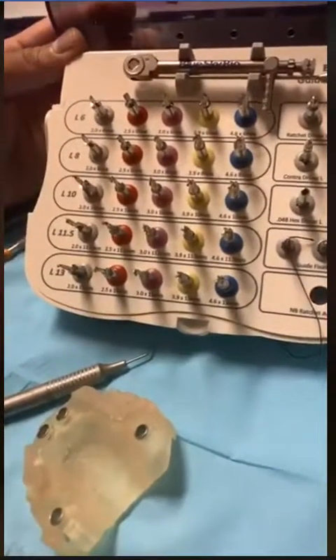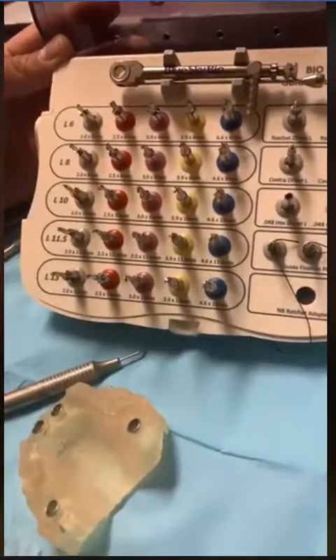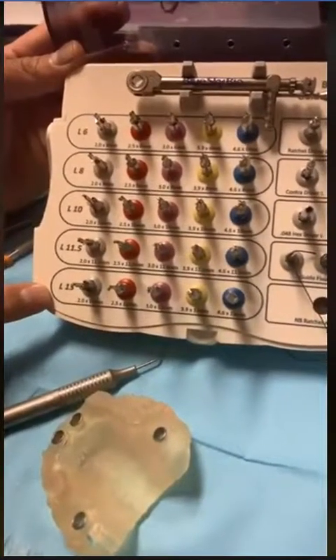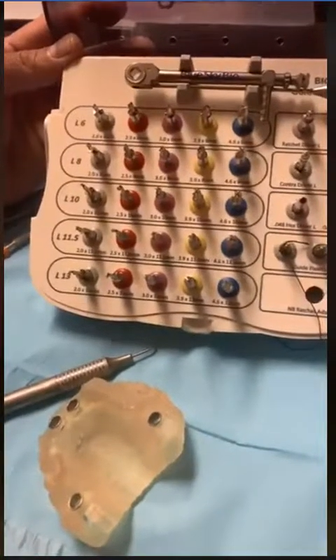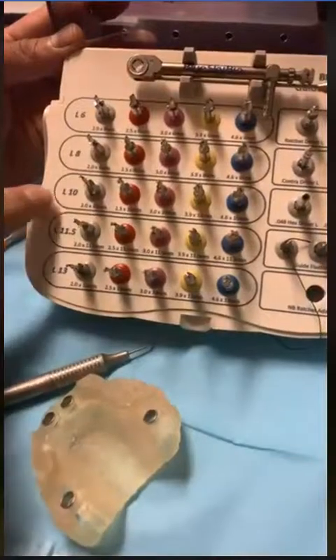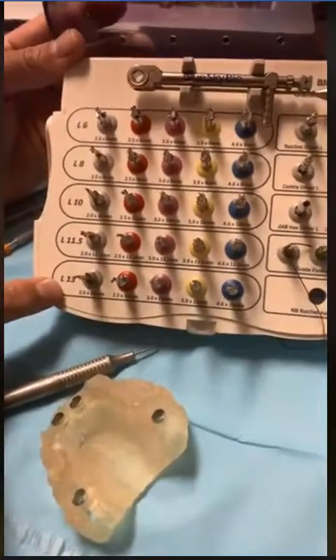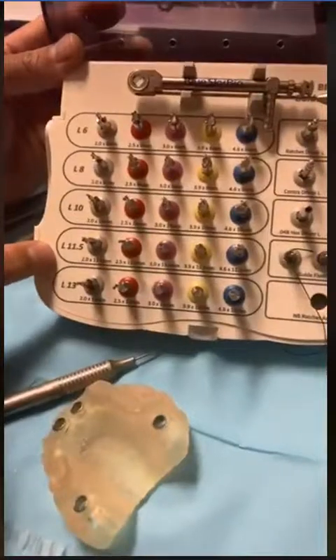But the sizes for this particular case, this is a Biomax keyless kit that has a 6 millimeter, 8 millimeter, 10 millimeter, 11.5, and a 13. Now, these numbers are basically standard numbers. Most implant systems have 10. Most implant systems have 8. Most implant systems have 13. Most implant systems may have 6 and 11.5.